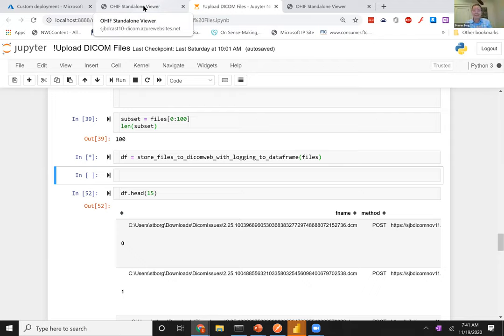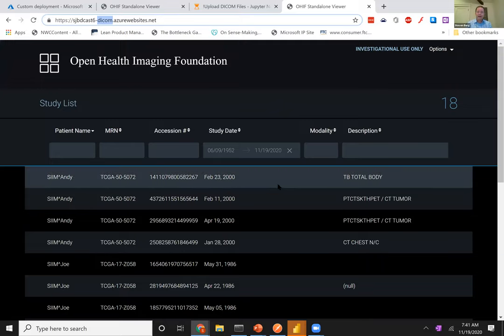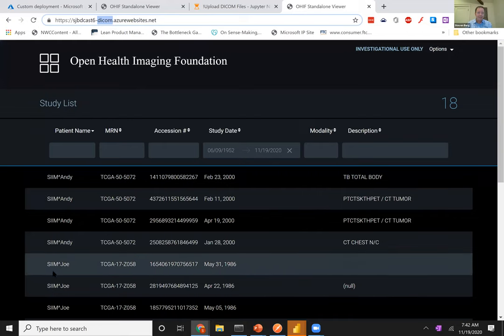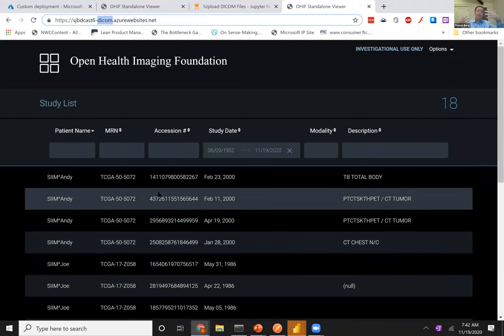While that uploads, let me shift to a pre-loaded viewer — a cake already frosted. This is a DICOM service, SJBDCast6-DICOM, with about 8,000 images I've uploaded — the images provided by SIM for their hackathon three years ago. Prior to uploading, I pushed some characters into FHIR: SimAndy, SimJoe, SimRavi, SimNeela, SimSally — I pushed these into FHIR first so that when I uploaded my DICOM files, they would link together with those existing patients rather than create new ones.